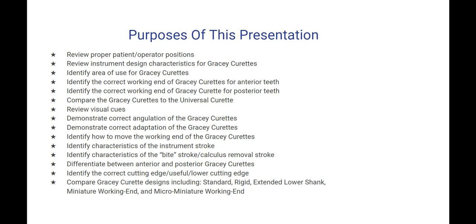Compare the Gracey Curettes to the universal curette. Review visual cues. Demonstrate correct angulation of the Gracey Curettes. Demonstrate correct adaptation of the Gracey Curettes. Identify how to move the working end of the Gracey Curettes. Identify characteristics of the instrument stroke. Identify characteristics of the bite stroke, the calculus removal stroke.